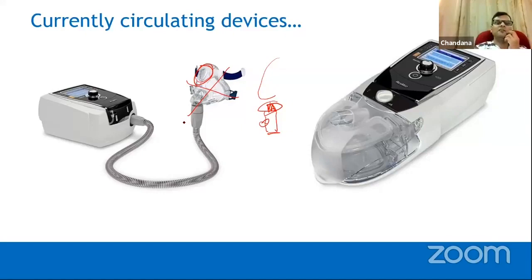Never ever try to connect the non-vented mask without an exhalation port. It's extremely important, because the patient will struggle and you won't know, and you will try to tighten the face mask thinking that the patient is not getting the pressures properly. So it is extremely important. And that is how you connect.